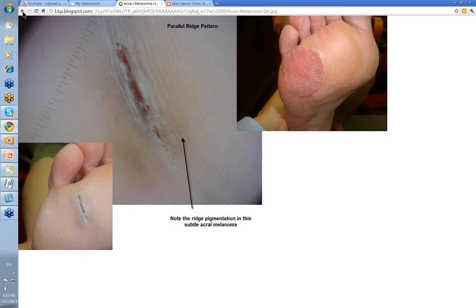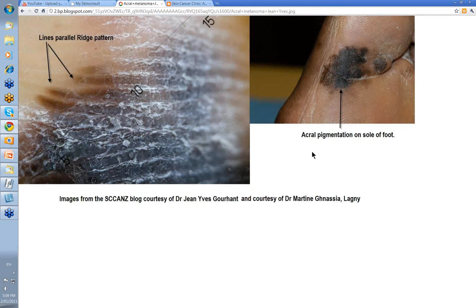Here is a much more obvious one. This image is from the SCCANZ blog courtesy of Jean-Yves Gourhant and Dr. Martine Ghnassia from Lagny in France. This was a lesion presenting on the foot of a gentleman with fairly dark-colored skin, with irregular edges. When you look at it with the dermatoscope, you look towards the edge of the lesion — and there it is again: pigment in the ridges, pale furrows on the side, and the broad ridges. A very obvious parallel ridge pattern — acral melanoma.